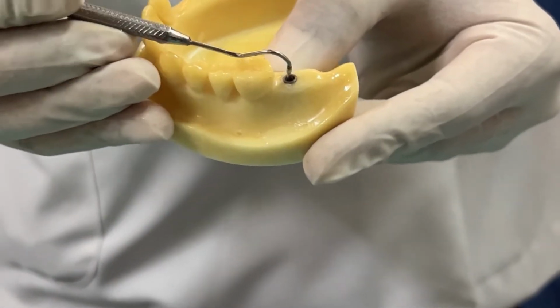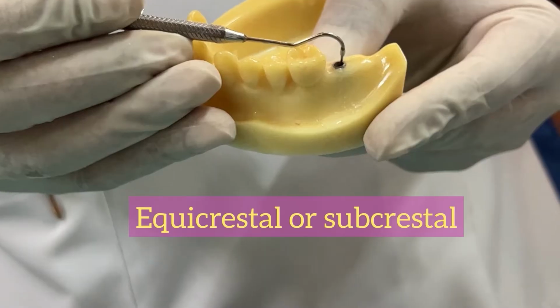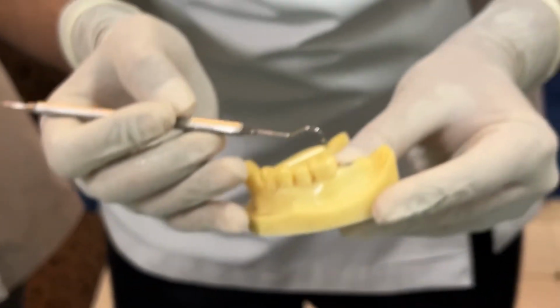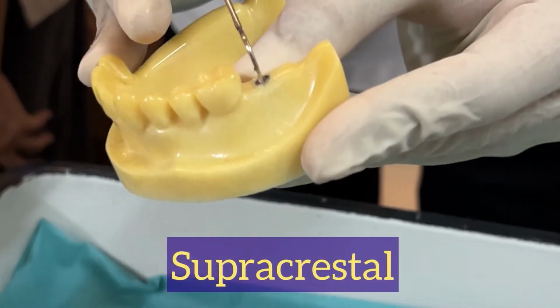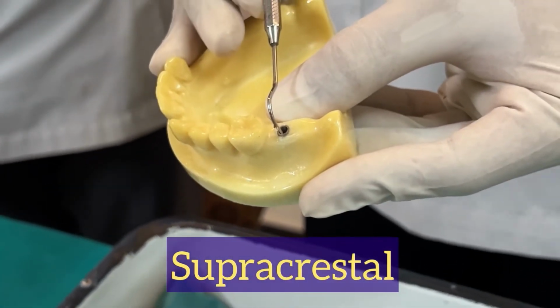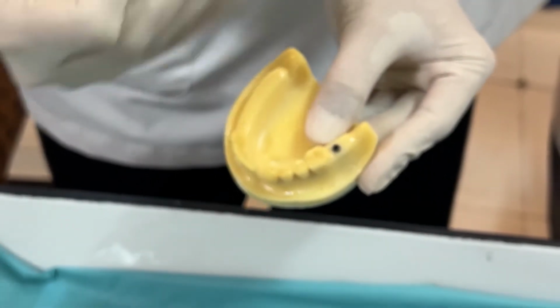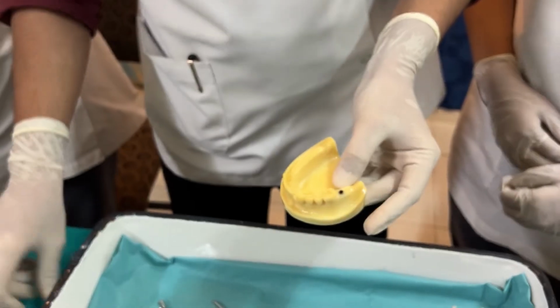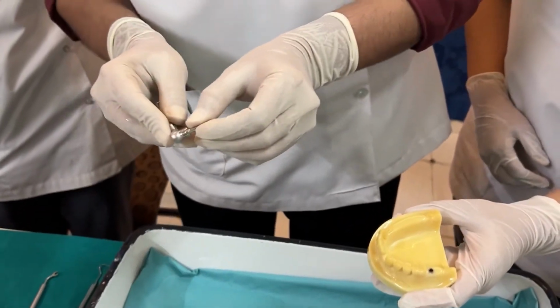So suppose it is sinking like this, that means either it is equicrestal or it is subcrestal. Suppose, for example, here it is still supracrestal. Suppose it would have been supracrestal, the moment you move it, your instrument will get stuck there. So what does that mean? My implant is still above bone level. I need to take it inside. So how will I take it inside? Now I have checked, maybe half a turn or so more I have to give.